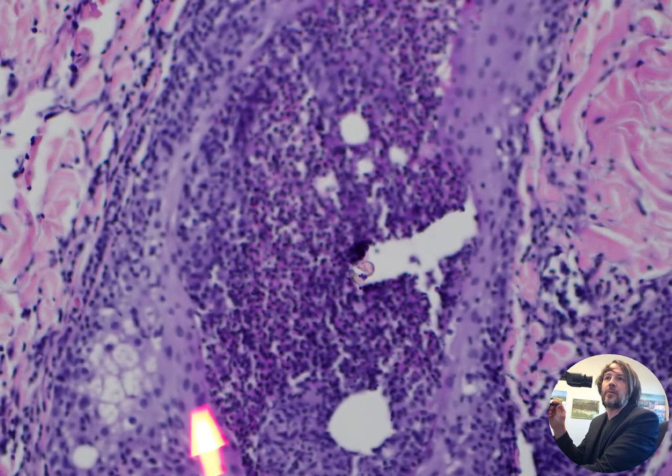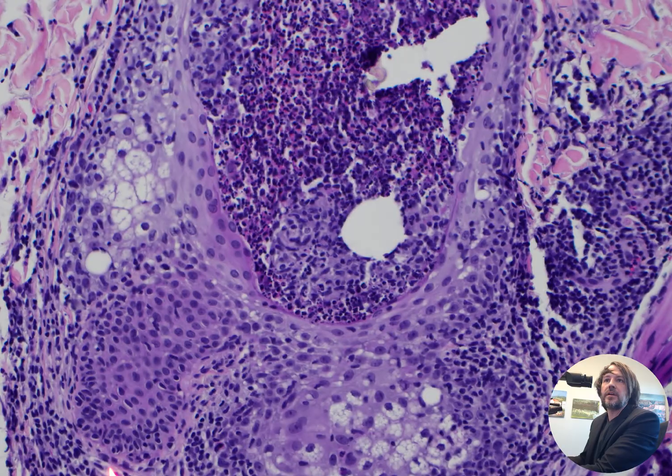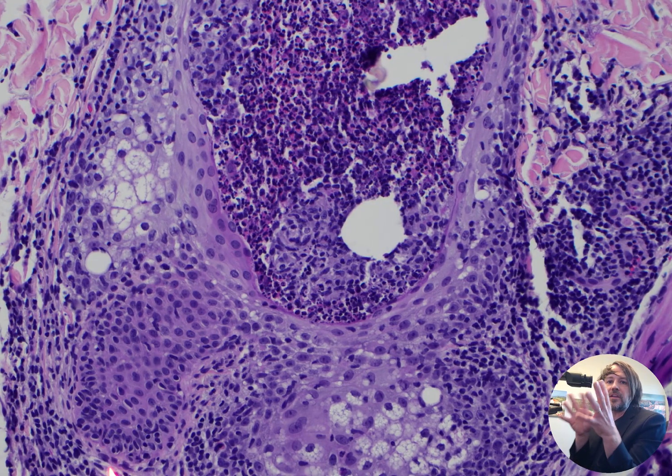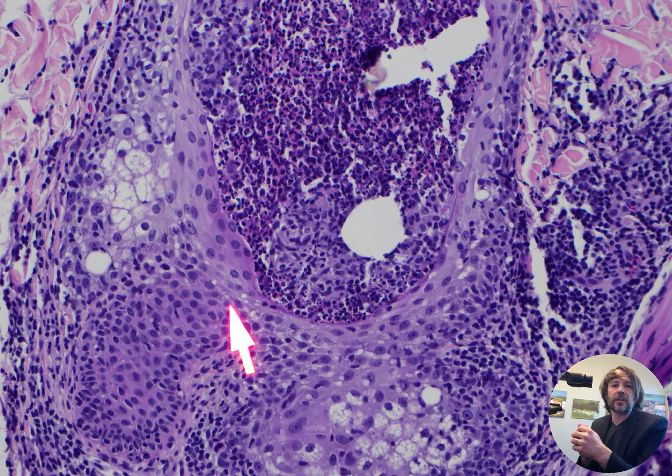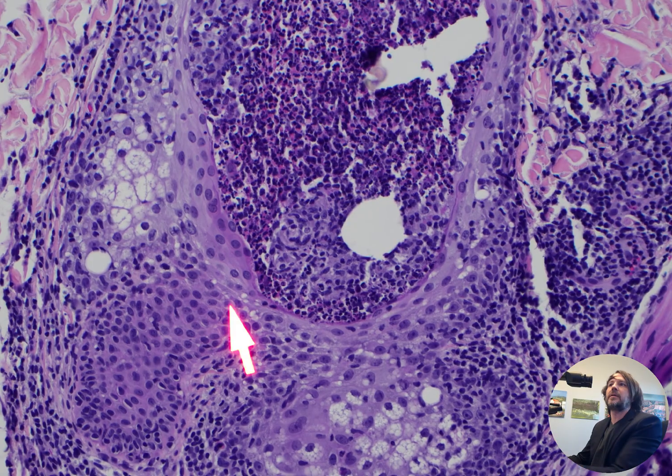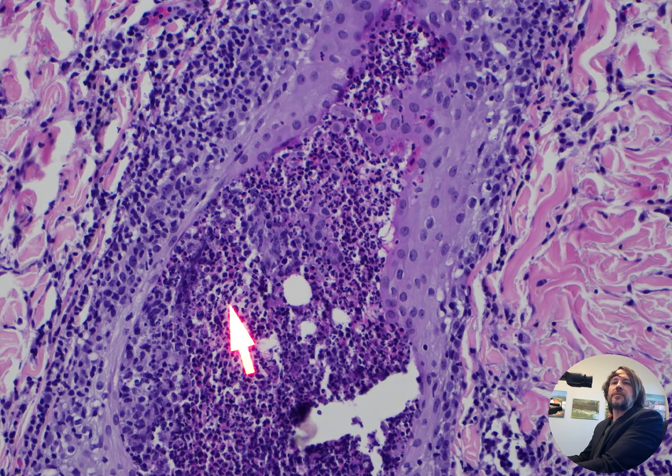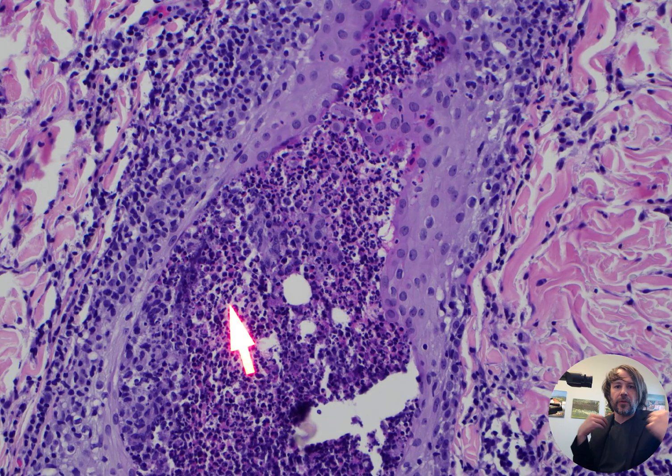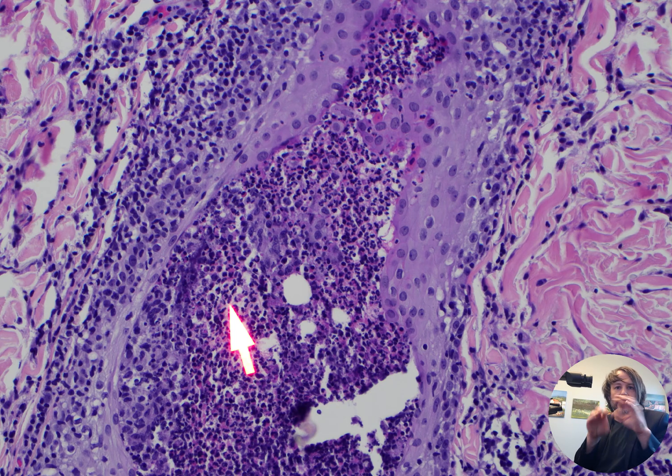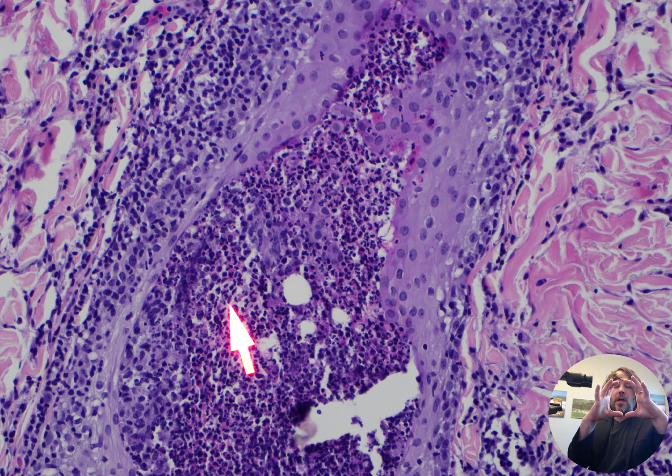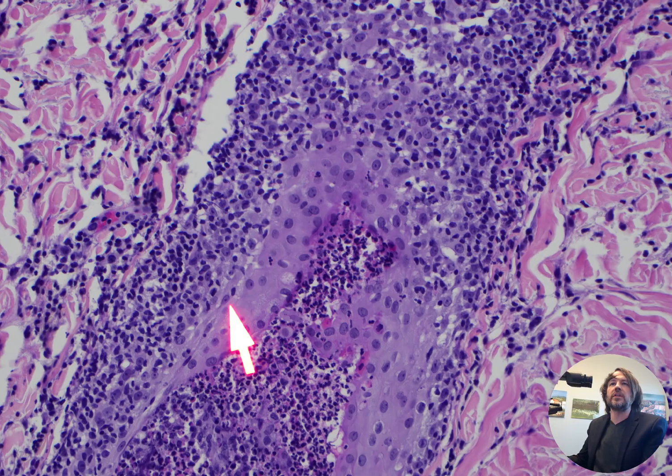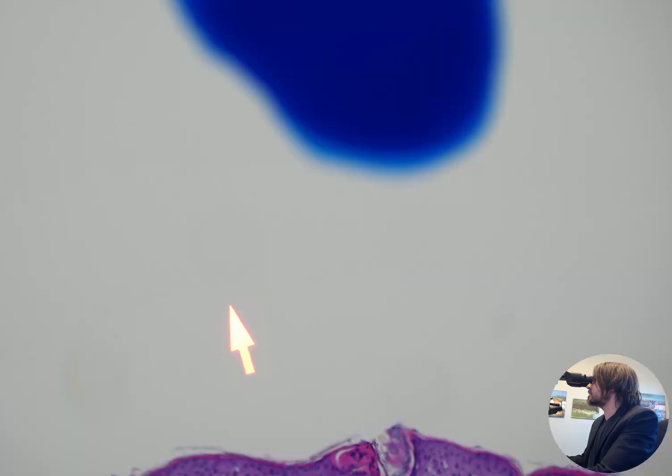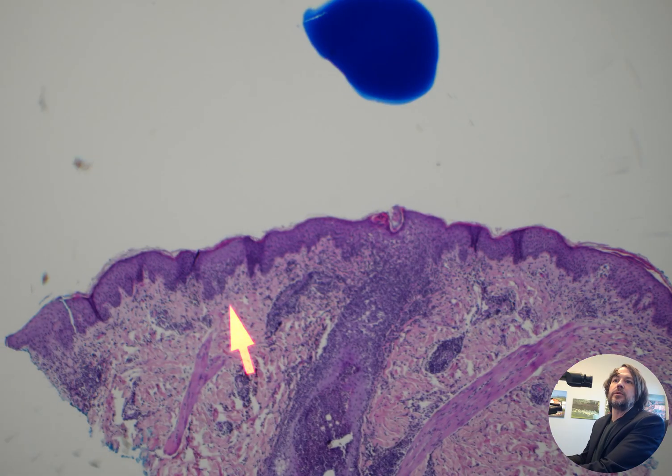So I thought, my first thought is, I'm going to do deepers and maybe do herpes stains to make sure there's not zoster here. Because the patient was given the anti-herpes, antiviral medication, but no one had ever swabbed the lesion and checked it by PCR to see if it was actually herpes zoster. So I thought, let me look closer. I don't see any zoster.